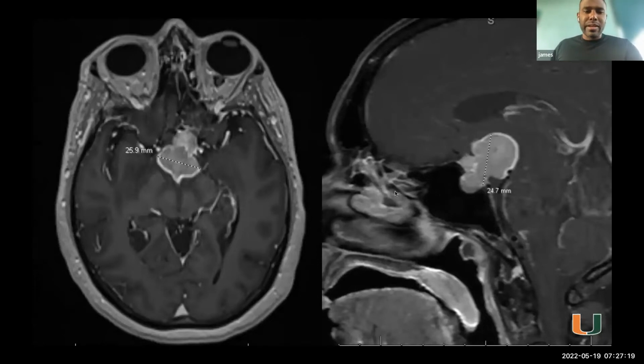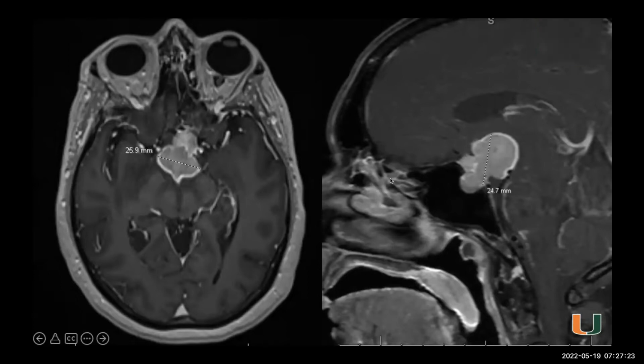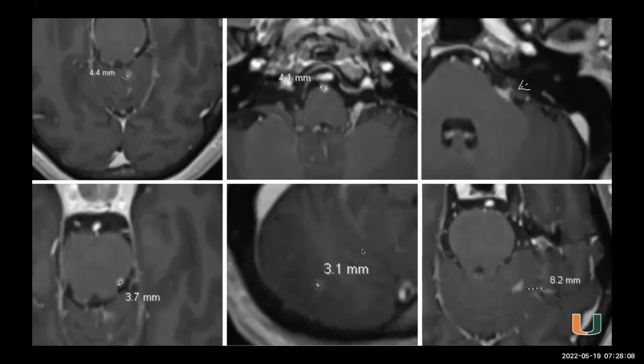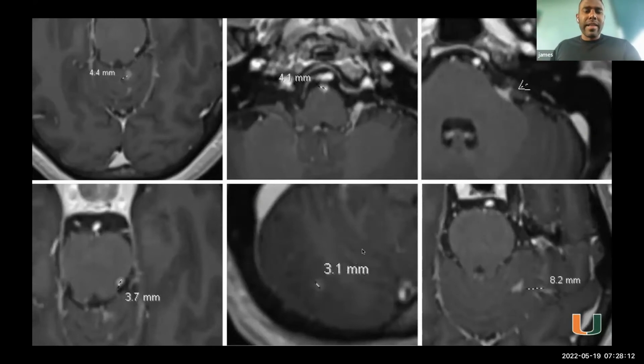And so here's the MRI that you ordered. Go ahead and describe it in terms of sequence and cuts. Yeah, so this is MRI axial and sagittal, T1 with contrast. It looks like there's a relatively homogeneously enhancing lesion in the suprasellar region, with maybe a bit more hyperintense enhancement around the periphery, superiorly. I can't really see the carotid; I can see maybe some of the carotid on the right side, but it extends laterally towards the carotids there. I could convince myself there's a little tail where the tuberculum would be, but that would be more of a differential for me.